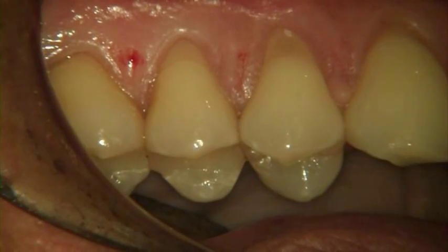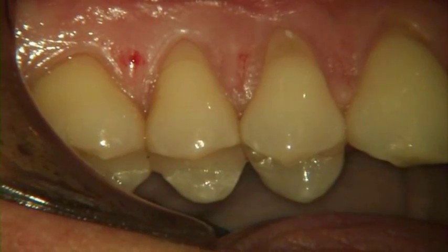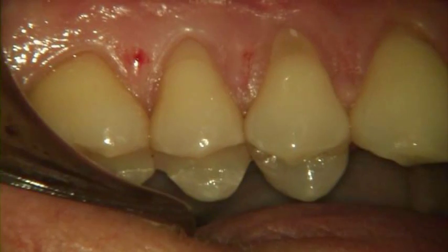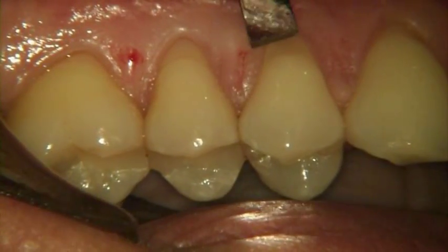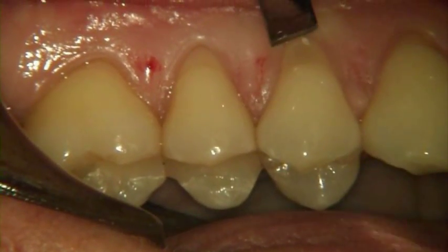The surgeon will place a Mucograft collagen matrix to cover the denuded root surfaces and to establish improved zones of functional attached gingiva. In addition to addressing the patient's desire to avoid an additional surgical site to harvest donor tissue, this procedure affords an unlimited supply of graft material, allowing the surgeon to treat multiple recession defects at a single visit.